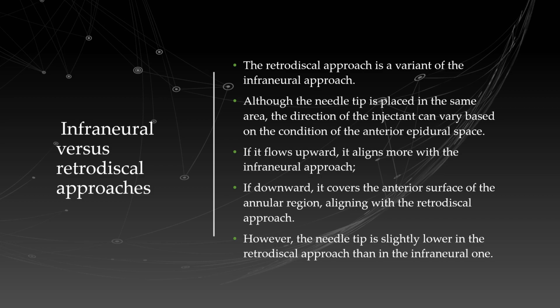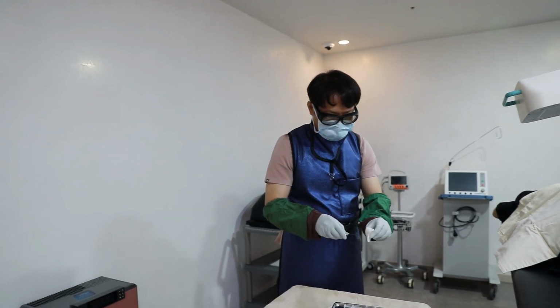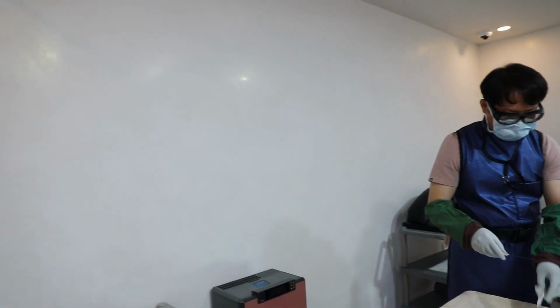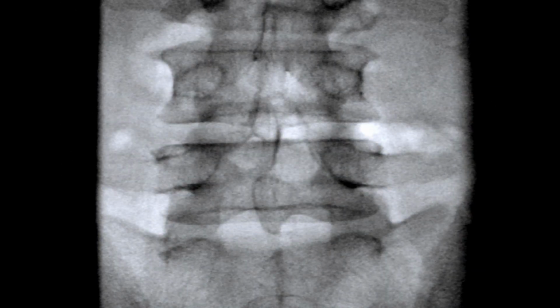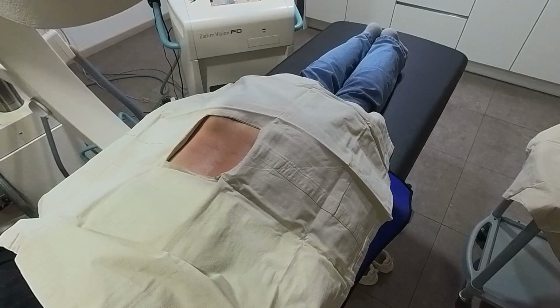Let's watch the cinematic display of C-arm images, needle manipulation, and the injection process, all while adjusting the C-arm's rotation and tilt. The procedure begins with my radiologic tech aligning the vertebral end plate. This image is achieved by tilting the C-arm and obtaining a right ipsilateral oblique view.